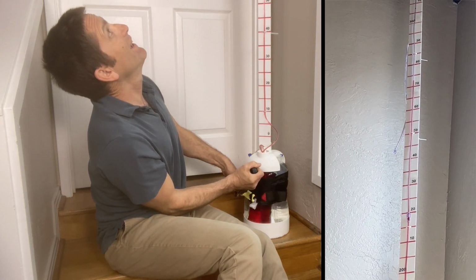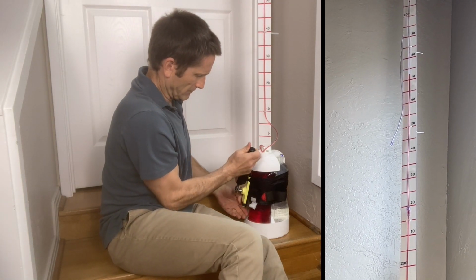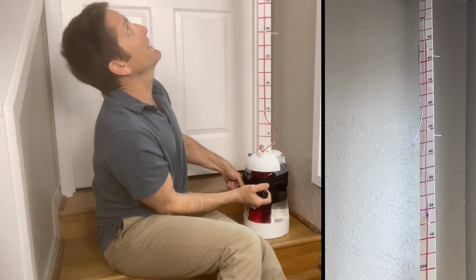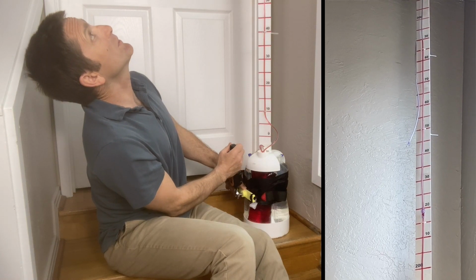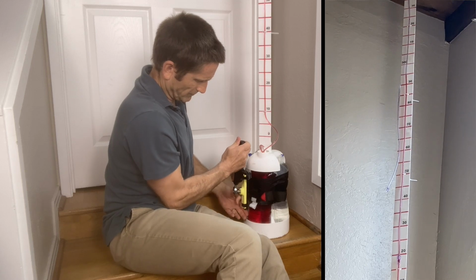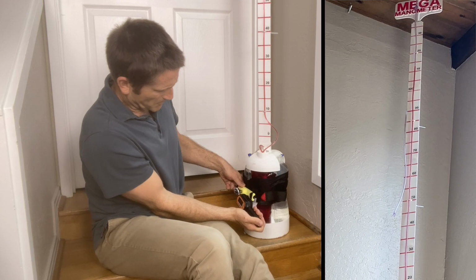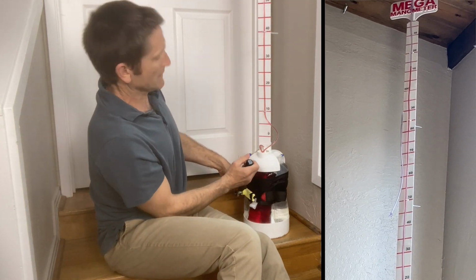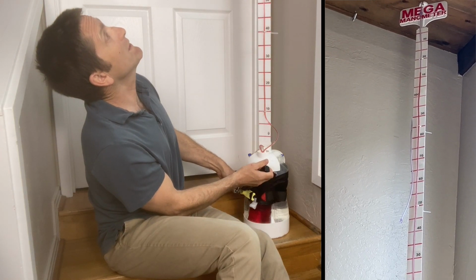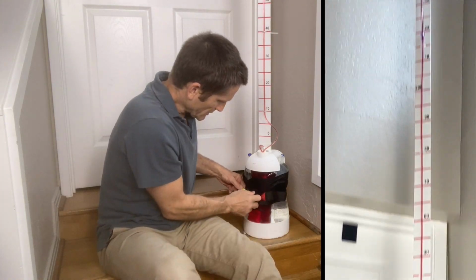4.23. 270. 4.23 again, and 290. Still 4.23. So, and pressure is 310. There's some deformation happening inside of here. Let's just see what's going on.